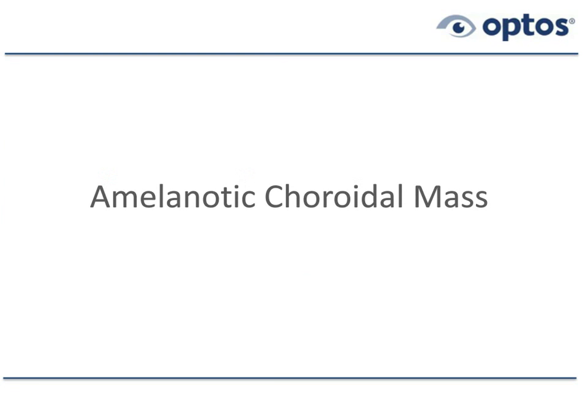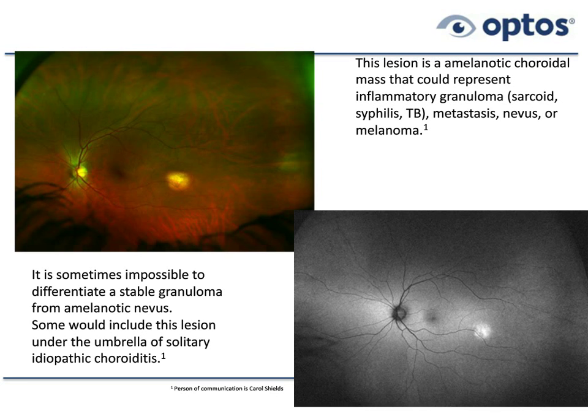An interesting disorder: an amelanotic choroidal mass — at the level of the choroid without pigment. We can actually have malignant melanomas which are amelanotic. Here's the color composite image alongside the autofluorescence image. Notice this lesion is hyperautofluorescent, meaning the RPE in that zone is sick or metabolically very active. The lesion could be an amelanotic malignant melanoma, or an inflammatory lesion such as an inflammatory granuloma due to sarcoidosis, syphilis, or TB.